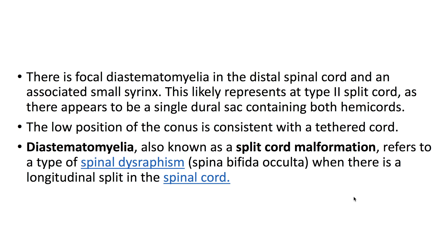This likely represents a type 2 split cord, as there appears to be a single dural sac containing both hemichords. The low position of the conus is consistent with tethered cord.